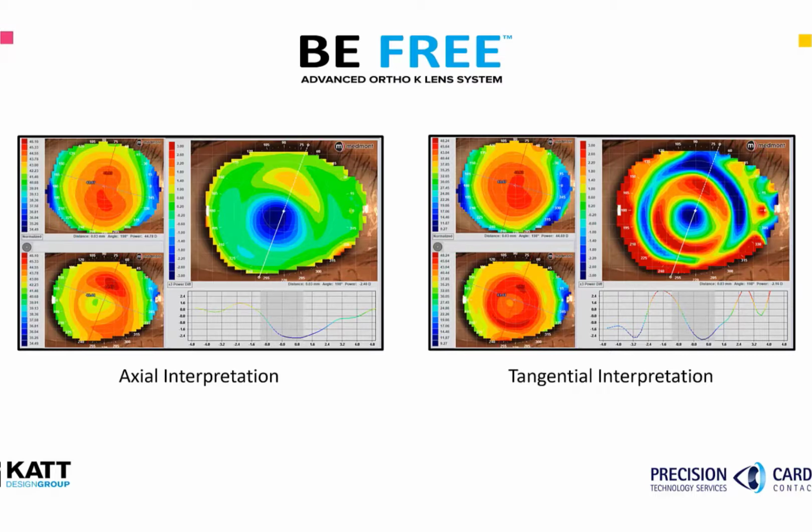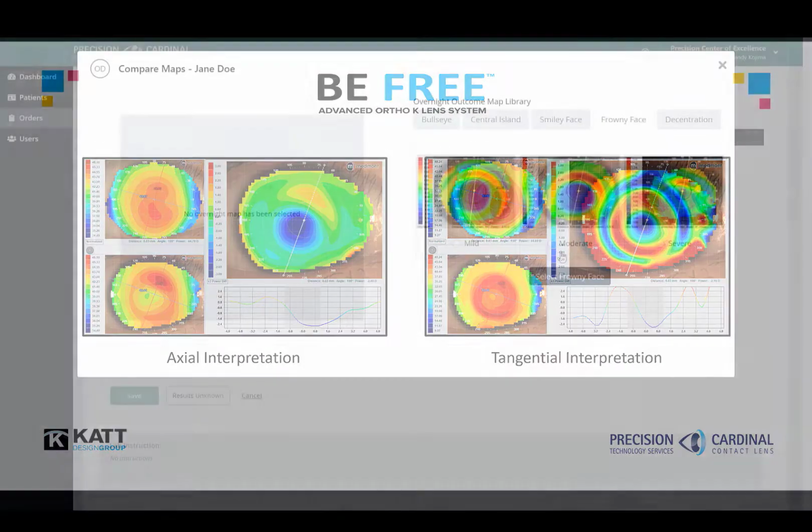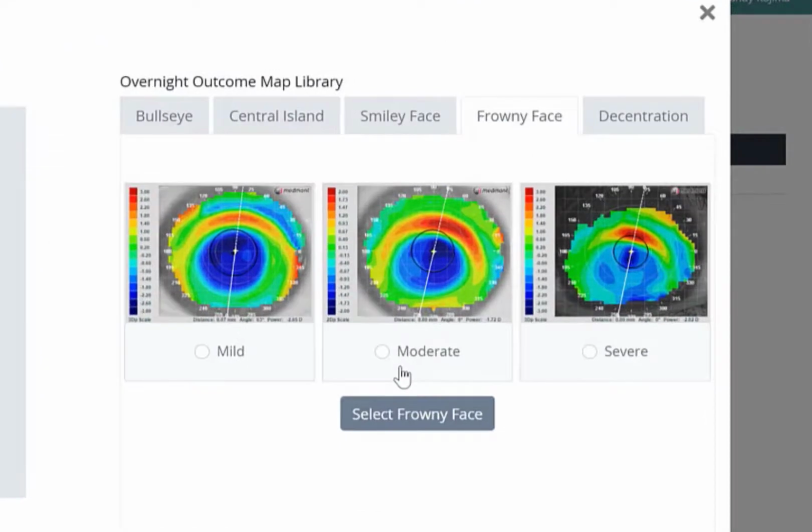However, the severe response might be appropriate if the patient's comfort were poor and you were seeing desiccation of the inferior conjunctiva. In this case, our patient's comfort was acceptable and the conjunctiva was clear. Moderate would most likely be the correct response. If you're ever in doubt, always choose the moderate response. That will create a significant change in parameters without being too mild or too severe of a change. Let's check the moderate response.